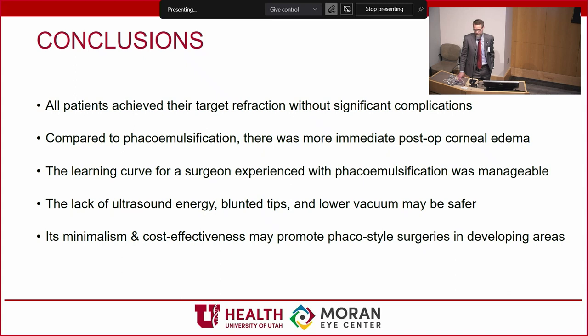What viscoelastic do you typically use in these types of cases? Yeah, so starting, my typical viscoelastic is DiscoVisc for all cases. I did eventually convert to DuoVisc using the dispersive to protect the endothelium. It was a noticeable improvement between the cases. Brian Selinsky operates with me. Brian, what have you noticed? Yeah, the big thing that I definitely noticed in the change for your cases once you started using this was a lot of central Descemet folds, which seemed very odd to us because most of the edema was closer to the wound. Since using that dispersive, there's definitely been noted less central Descemet folds. The corneal edema is still present, but the central Descemet folds are a lot less, for sure.